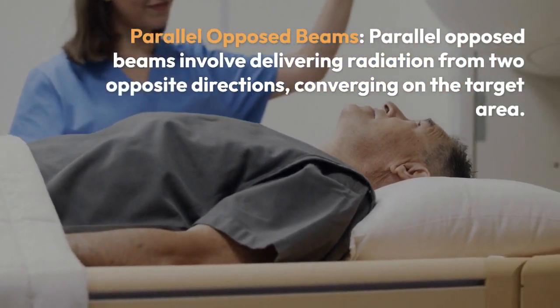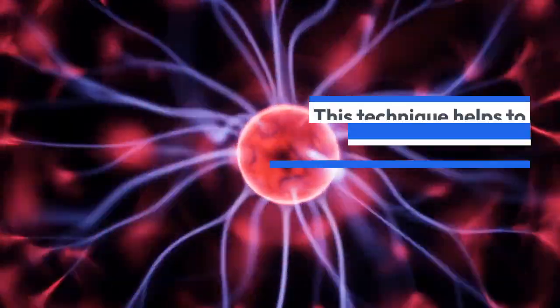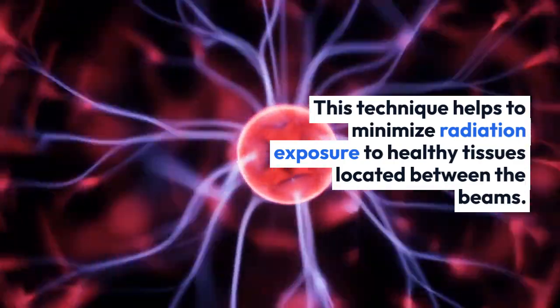Parallel opposed beams. Parallel opposed beams involves delivering radiation from two opposite directions converging on the target area. This technique helps to minimize radiation exposure to healthy tissue located between the beams.